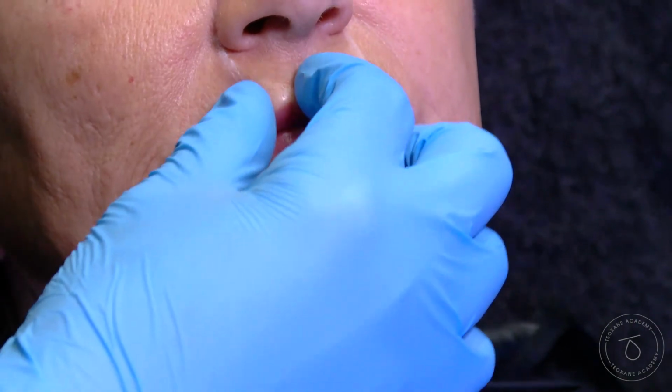Do you inject sometimes the cupid bow, the vermilion border? I can if I wanted to try and give her a little bit more anterior projection. I would just swap to a needle there, and I would literally just go about just 1/3 there into the philtrum column and retrograde a tiny bit of product. But I think that with just volumizing the lip from a lateral view here, you can see very, very nice projection there of her GK point.